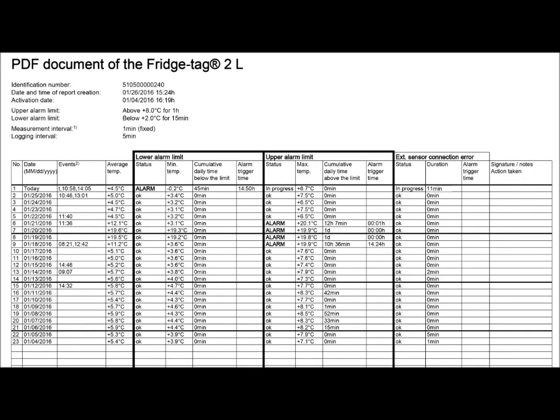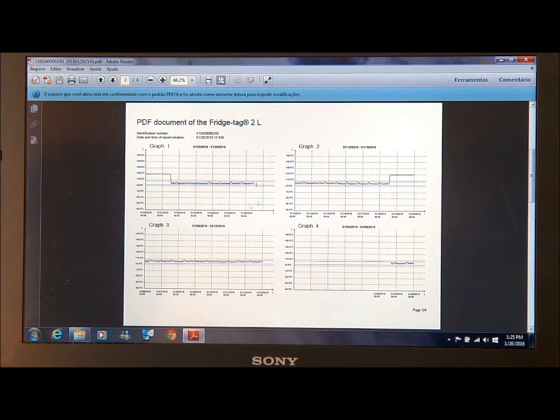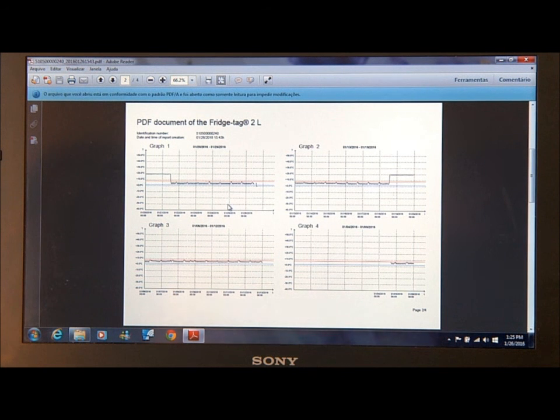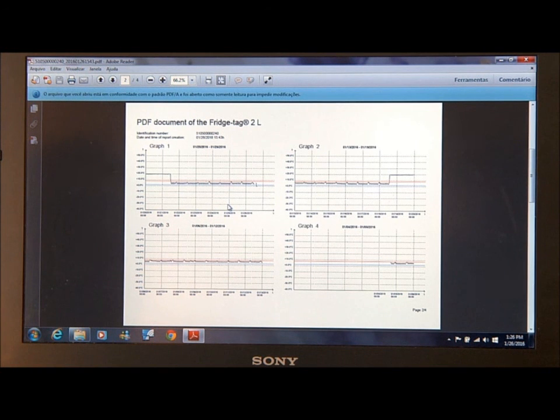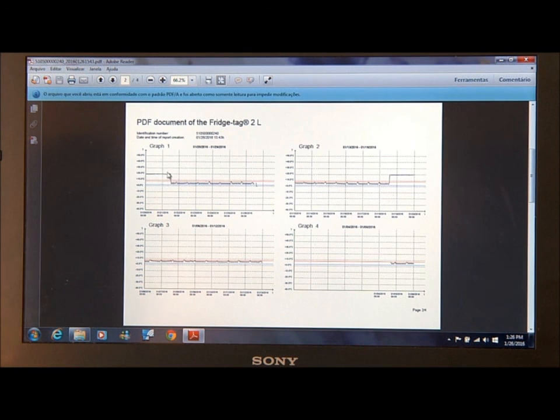With the Fridgetag 2L, you have a second set of data in the PDF. You'll see weekly graphs of all the information, and you can see in this past week that there were some high temperatures.